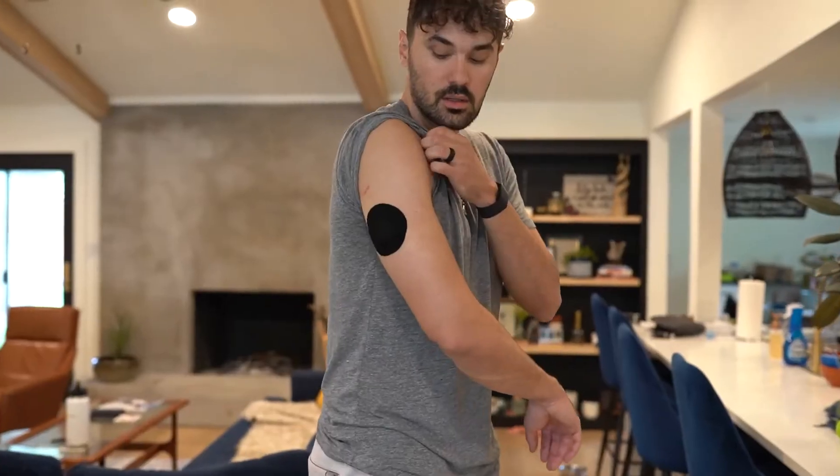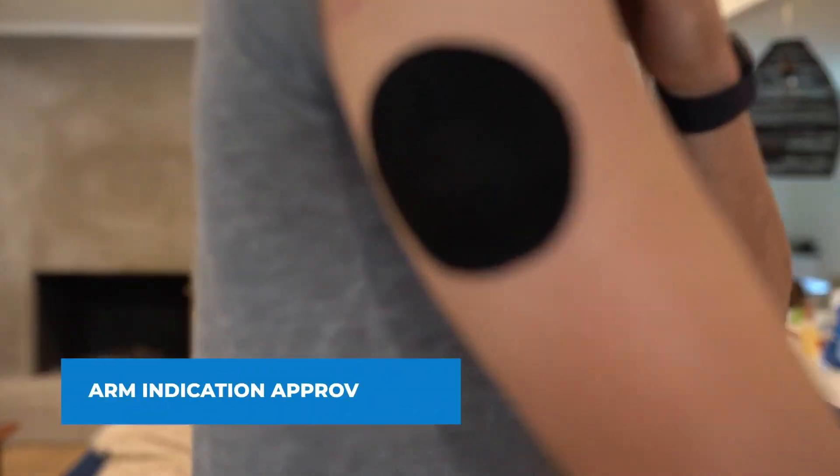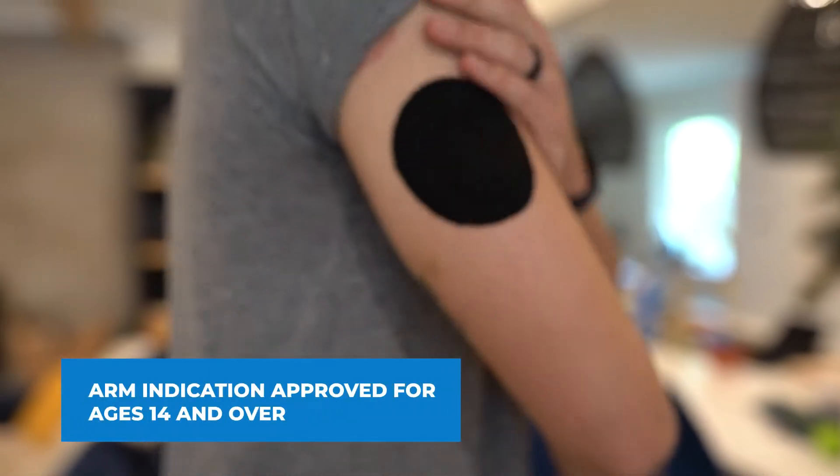I have a video where I talk about the insertion of my Guardian sensor on the back of my arms. I like wearing it there because I think it gives me the best opportunity for the sensor to last the full seven days, and because the sensor takes less damage on the back of my arms, I find the readings to be more accurate. Be sure to check out my recent arm insertion video to learn the full proper steps from Medtronic.